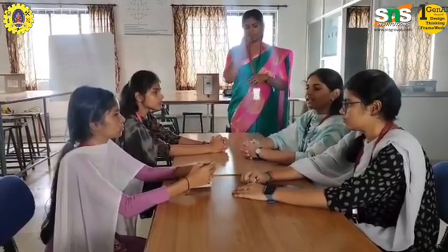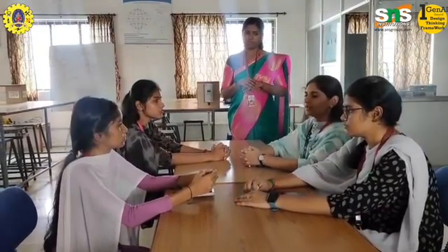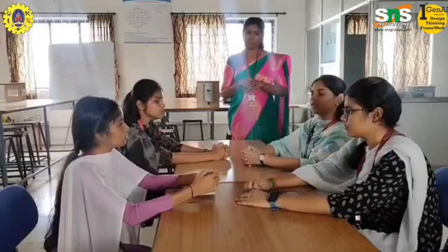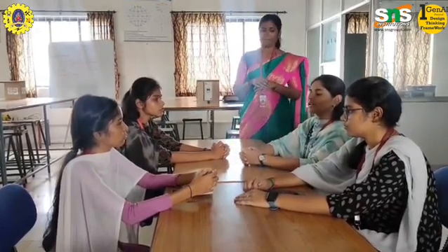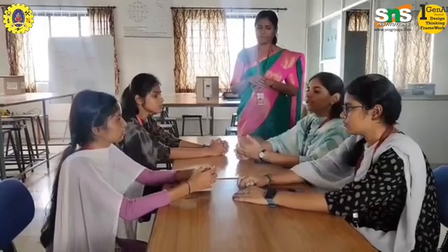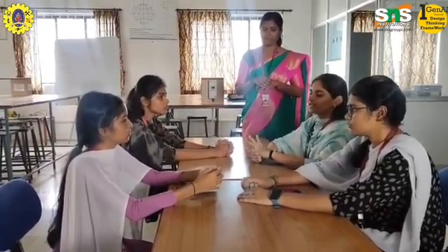It requires a skilled person to handle this equipment properly. Another thing is it is not suitable for all patients. It might be a disadvantage for patients with cancer, fracture, infection, and it also affects pregnant women.